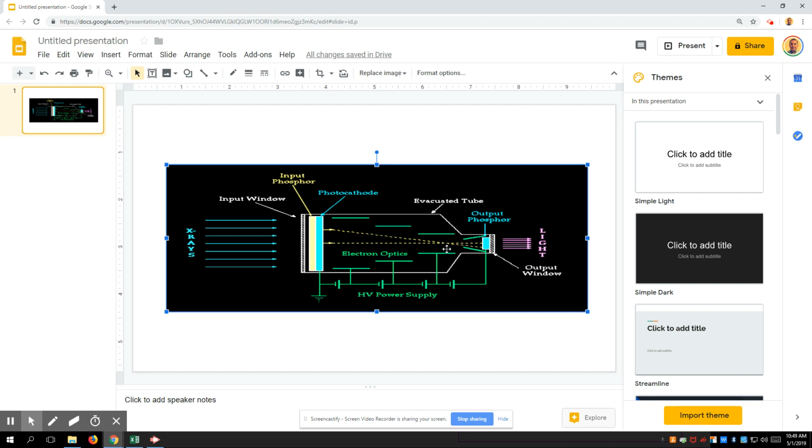So magnification mode has the advantage of better resolution, but the disadvantage is increased patient dose. That's right. That's the way a lot of radiology is. Better images, more dose. So geez, I hadn't written down magnification on dose. So yes, right? Multi-field number down, going from 16 to 9 gives you magnification.